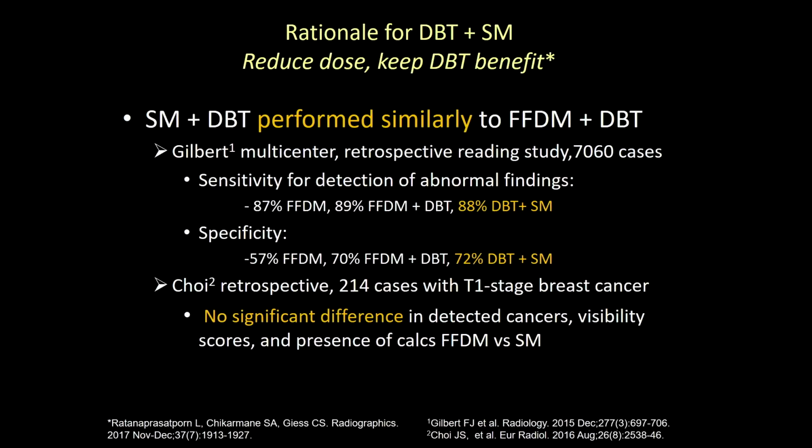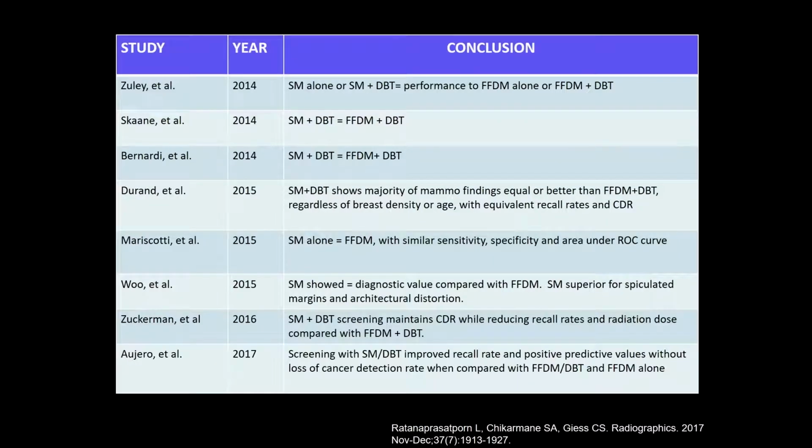calcification. So pretty equivalent. This is a big chart summarizing a bunch of the studies looking at synthetic. I won't go through each one, but you can see from the chart that basically synthetic plus tomo performed equivalently to full-field digital plus tomo. So we don't like it as much. It's not pretty. It's a little granular. It's a little flat as an image, but at least in clinical practice, it's performing the same way.